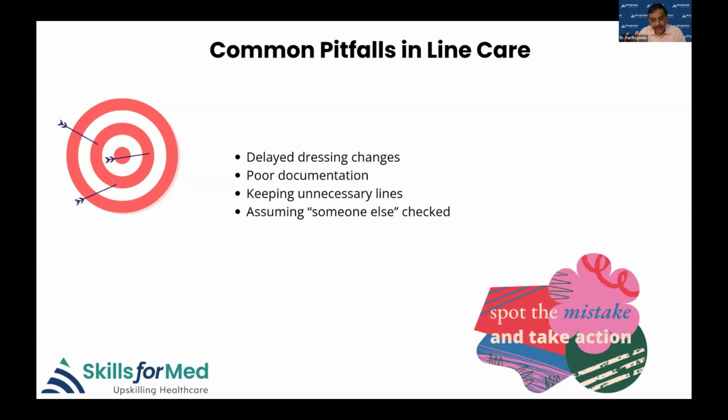And the third most important, we keep emphasizing this, don't keep a line more than what is necessary. There is a study which showed that for every additional day the line is in place, the CLABSI rate goes up by 2%. Every extra day it is there, it goes up by 2%. So whenever it is not necessary, just remove it. And again, assuming that someone else checked. You need to make sure that you go through the checklist yourself and don't assume that somebody did that. So these are the common pitfalls in line care. Next slide, please.